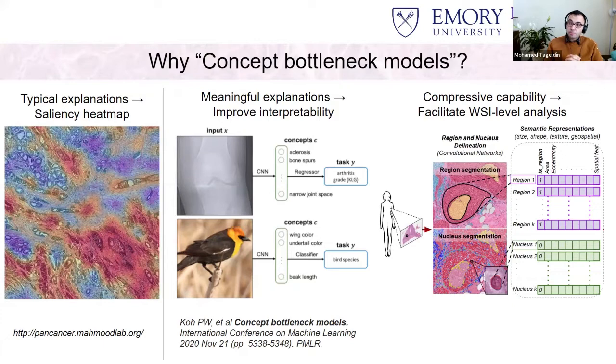But of course, in terms of interpretability, it's not the best, because here, for example, it's not very clear why it's focusing on the cancer areas as well as the stromal areas in between, but not these cancer areas. It's not very clear that the mapping is 100%, and also it's pretty subjective. Someone might say, okay, this may be relevant as well.